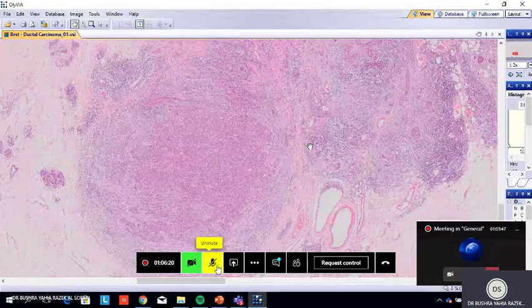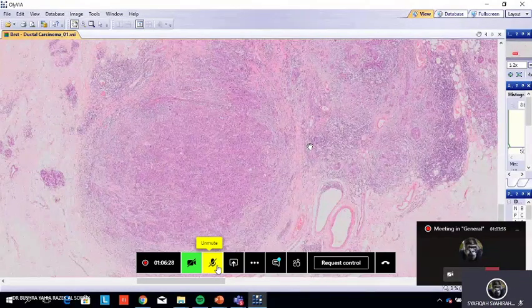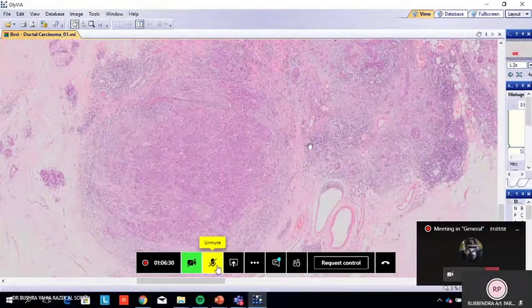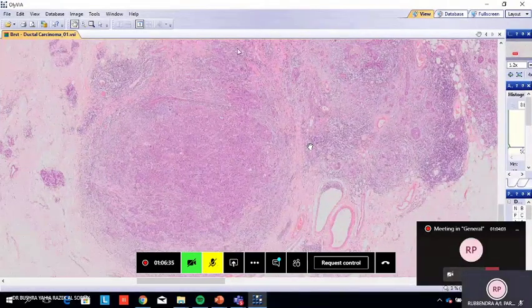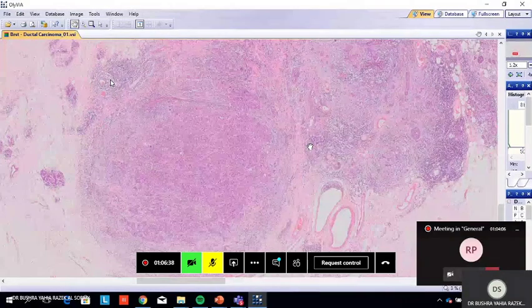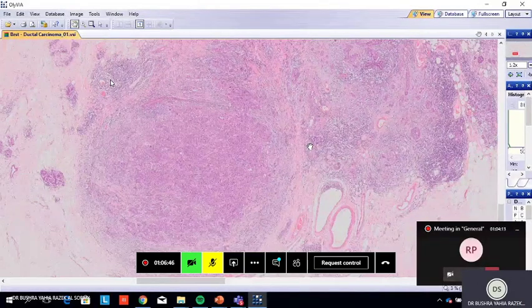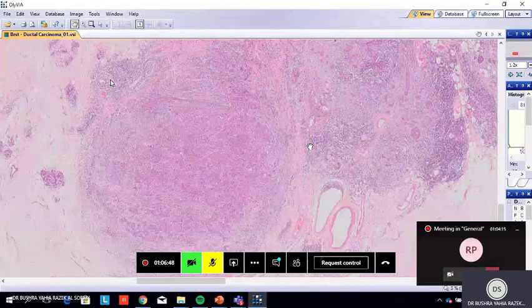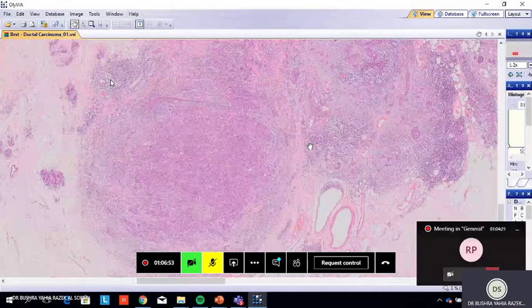So how to compare? Here there's infiltration into the surrounding tissue. Local invasion. Yes, invasive. So fibroadenoma is not invasive. Okay. What else? The differentiation. The cells are large with irregular nuclei. Poorly differentiated, and the number of cells and ducts.